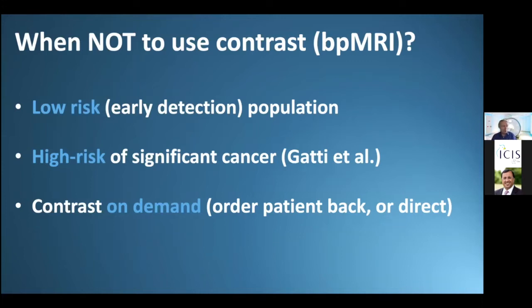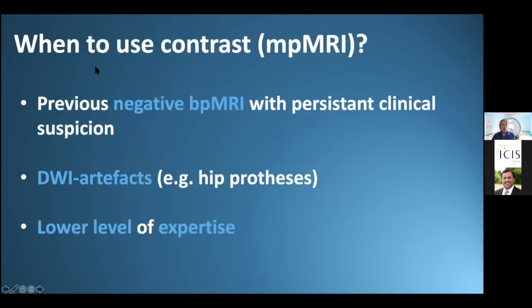There are also institutions who have a radiologist on the spot, and he directly decides whether the patient needs to have contrast or not. It's quite time consuming and, well, not that effective. We're not doing that. Now, when should you use contrast?